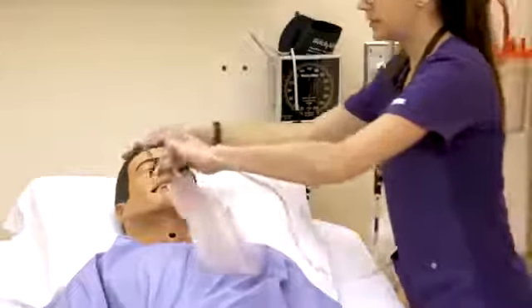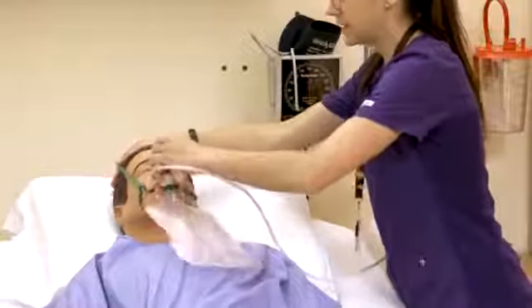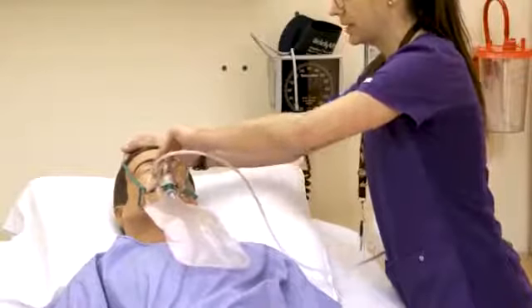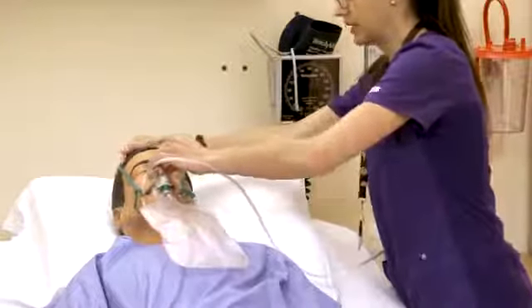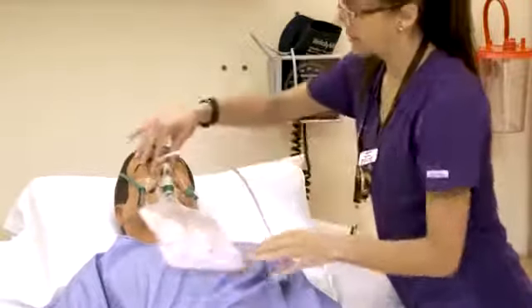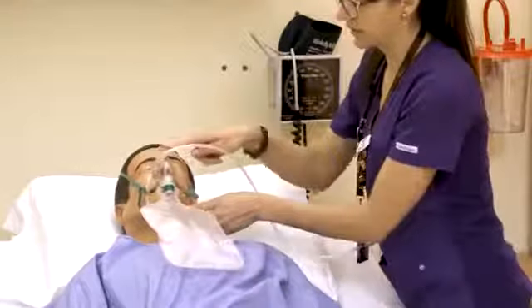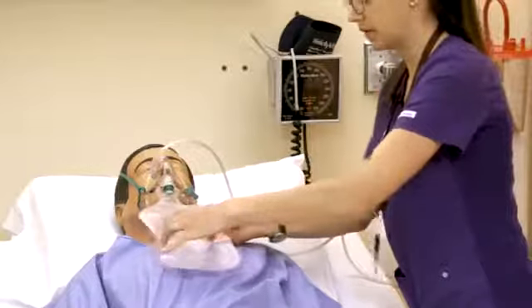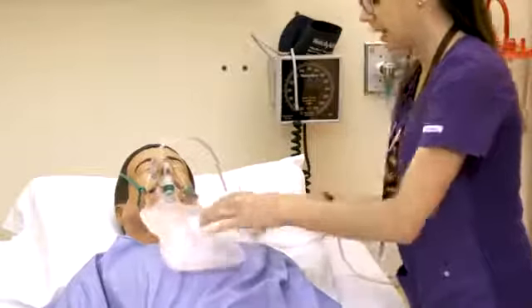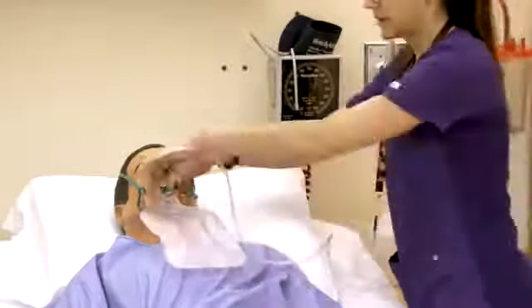So same idea, you would just affix this to their face. Our nose piece has come off a little bit, but you'd want to make sure that that was on correctly there and closed off. So again, pinching it on the bridge of their nose, it fits nicely under their chin, making sure your reservoir bag is full at least, and then monitoring the patient with this one as well.